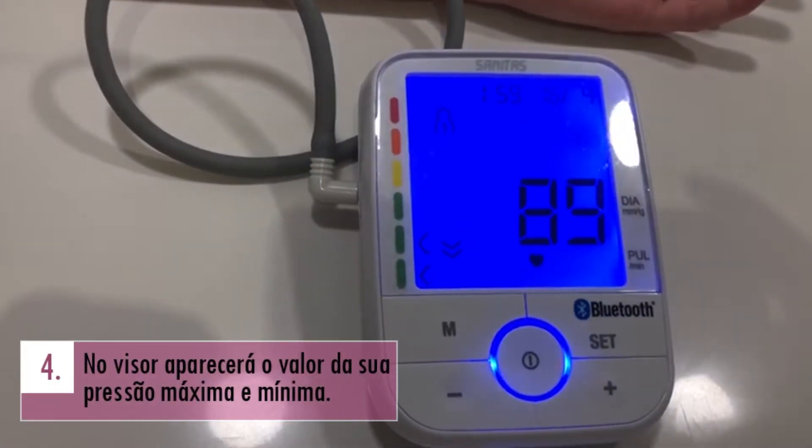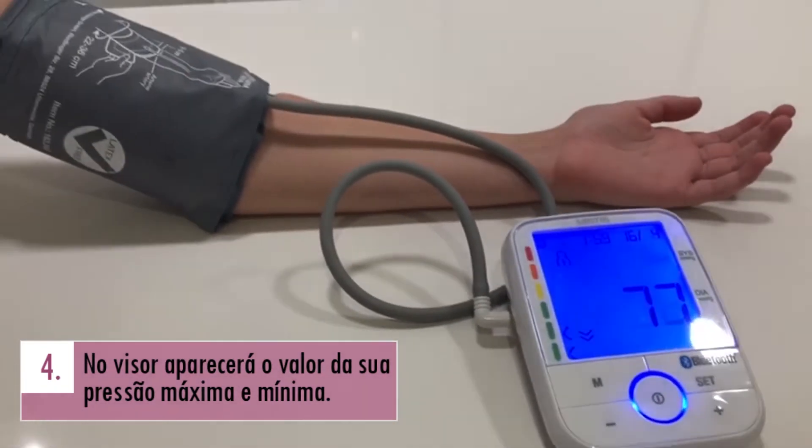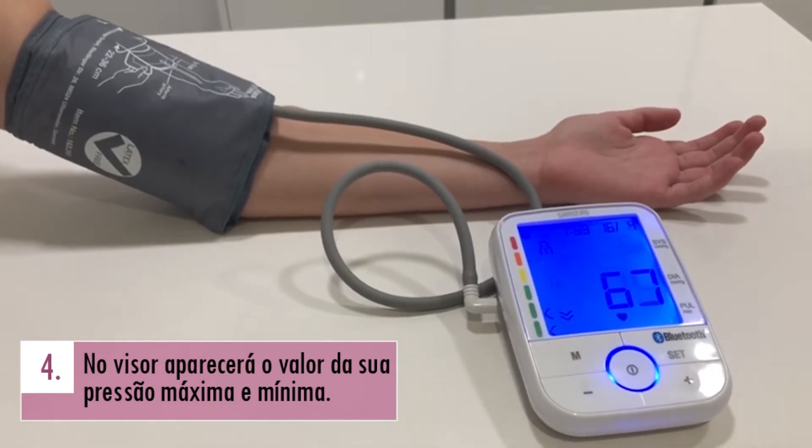No final do processo, aparecerá no visor o valor da pressão arterial máximo, da pressão sistólica, e mínimo, da pressão diastólica.